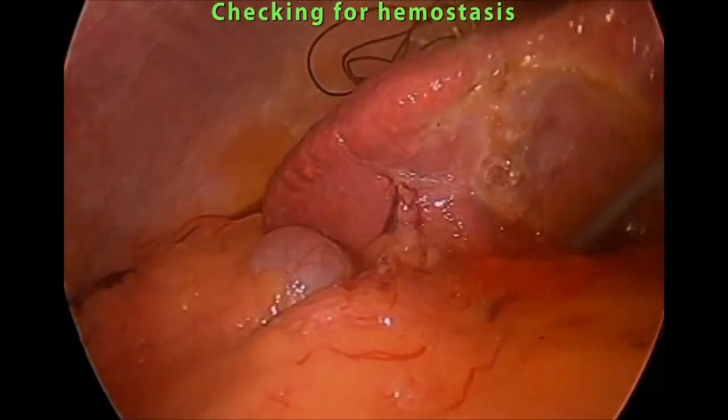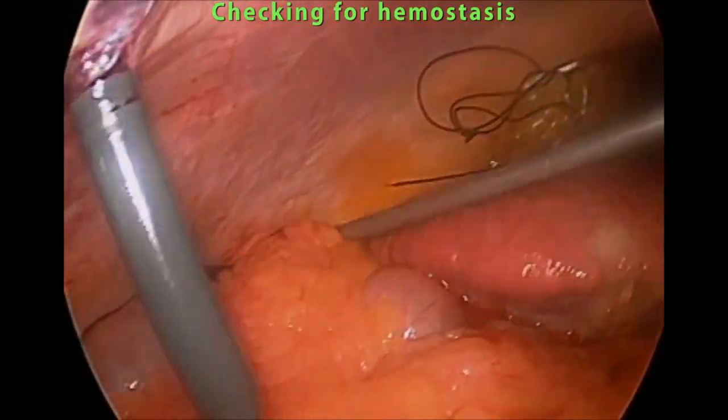Looks like the hemostasis is secure. And this concludes our video.